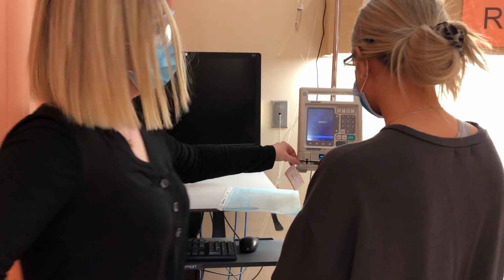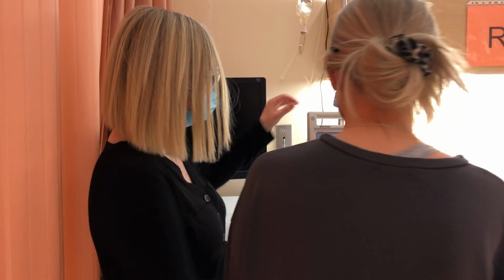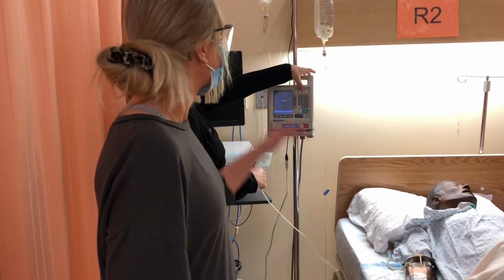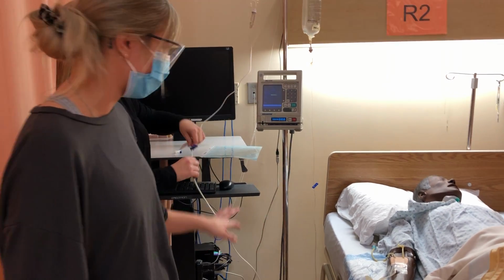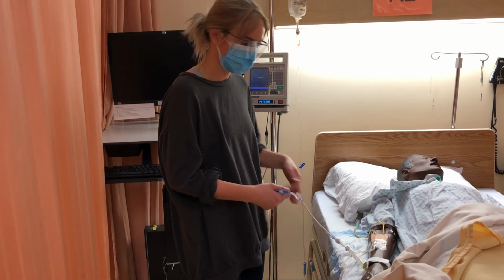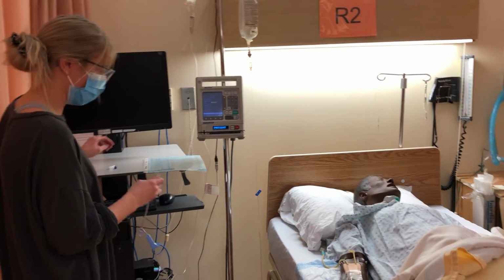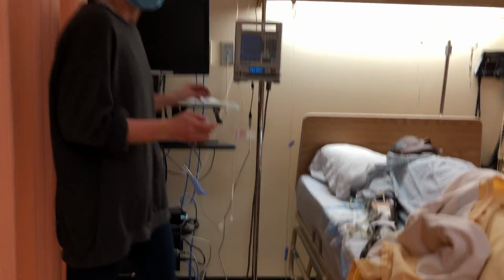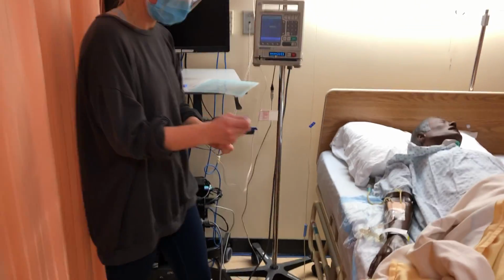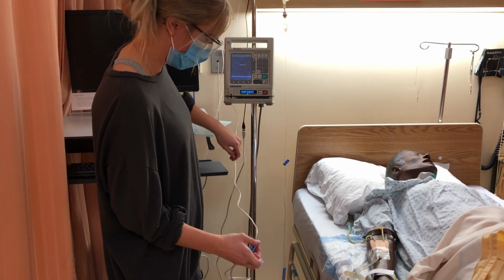Okay, so you can still go back and fix this. So tell her what you did or didn't do and what you're going to do. Okay, so at this point we didn't prime the line, so it's okay. We can still fix this because it hasn't been started. So I'm going to open and run it. Unclamp from the patient, I'm going to run it here, and then I will see that it's infusing, that's going to be light. It's going somewhere. So I'm going to close it and I'm going to lock the PCA.